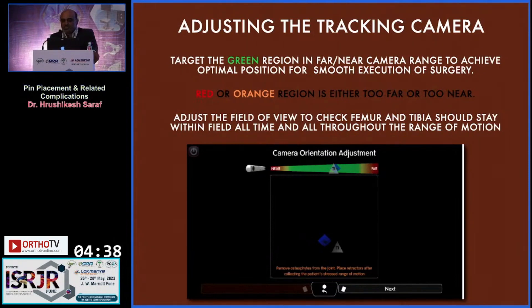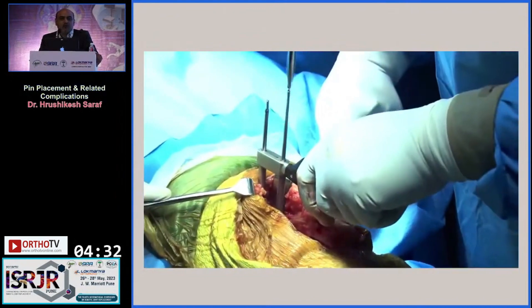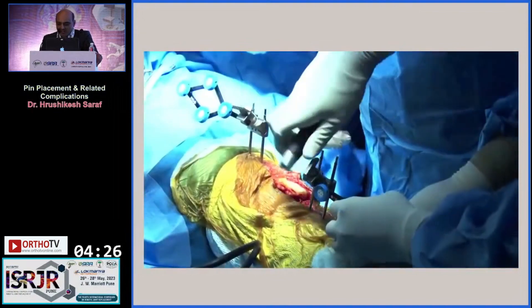The red or orange region indicates the tracker is either too far or too near. The way we put the pins is two pins anteriorly in the femur, and two anteriorly on the tibia.